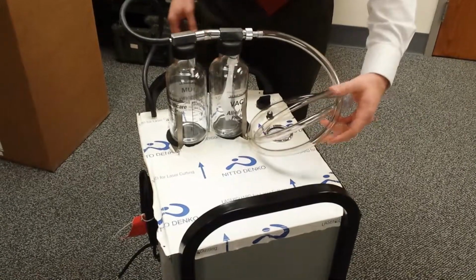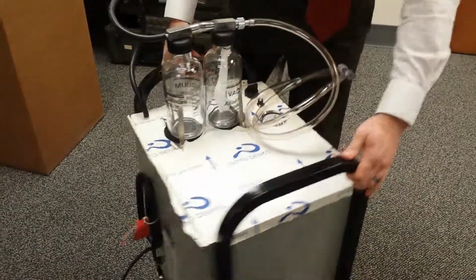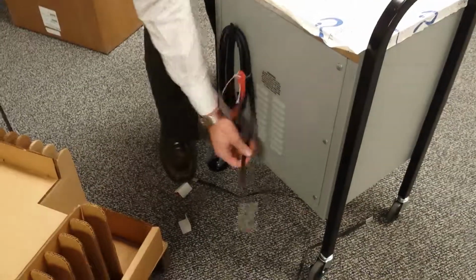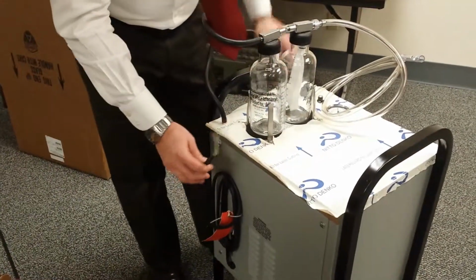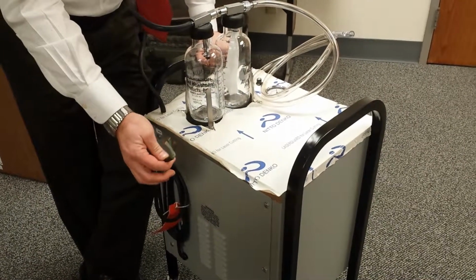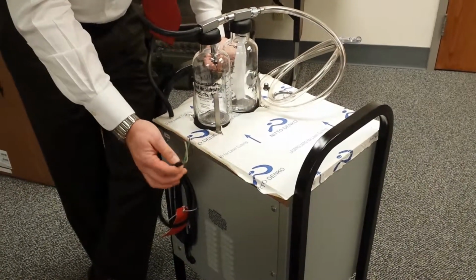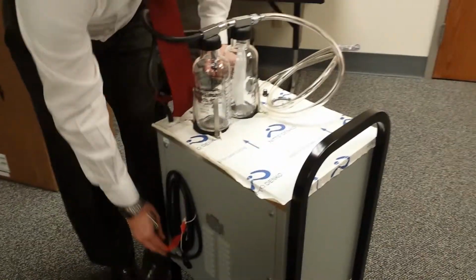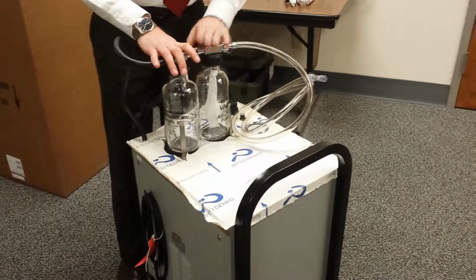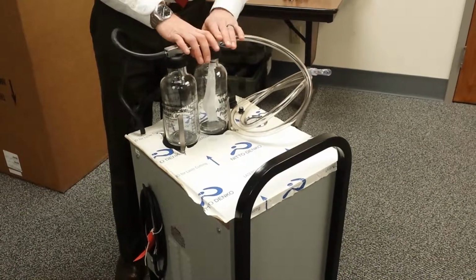Now here's one important note about the Gomco 3830. It's an explosion-proof pump. Because there are many different models of explosion-proof plugs into the wall, the Gomco 3830 comes without a plug on it. So before you use the Gomco 3830, you're going to need to find out from your department manager which plug you're going to need to use, and get the appropriate plug and have it installed. But once you've done that, the Gomco 3830 will be ready to go. You have your tubing set up as such, and again, you can use disposable or reusable tubing depending on which nipple adapter you use.